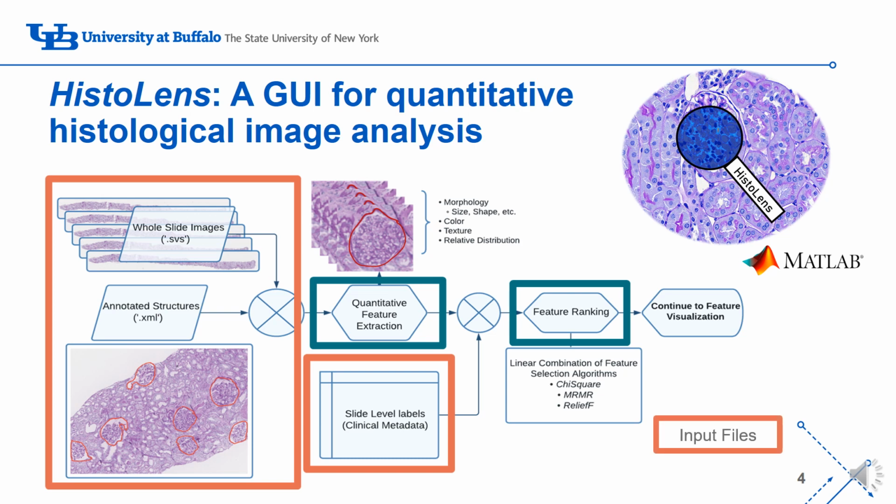To account for these existing challenges, we designed a standalone desktop software for quantitative analysis of histological structures using MATLAB. The input files for this graphical user interface, or GUI, are whole slide images and their corresponding annotation files. These are generated automatically when making annotations in platforms such as Aperio ImageScope.